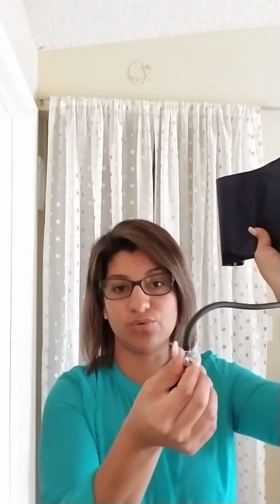Here you can see the measures. There's actually different numbers here that indicates the arterial pressure, which is the blood pressure that you receive. Here's your balloon pump. So this actually blows up the cuff itself. And then right here, you have a little tool that you can tighten, and then you release it to let the pressure go. So this one's pretty neat.